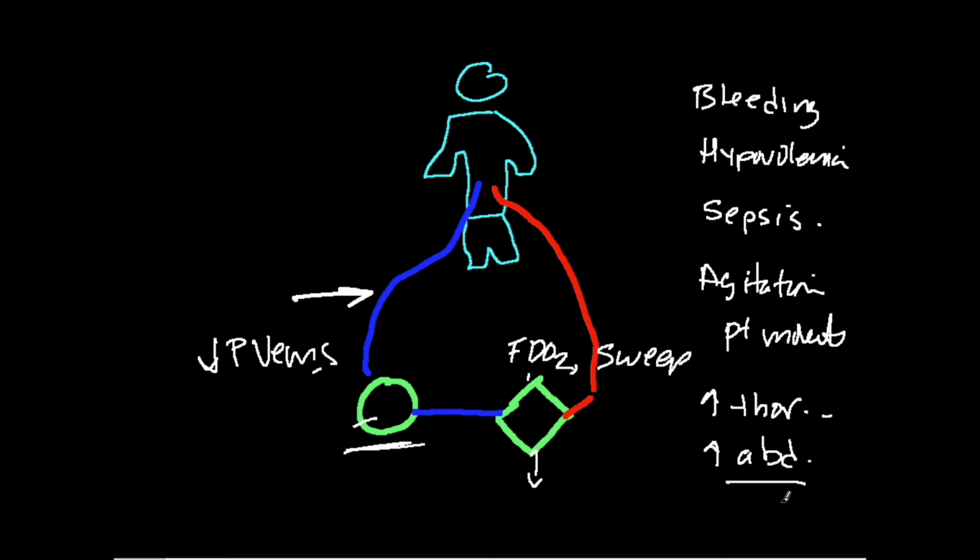And then finally, the cannula can be misplaced. This could be something that's been chronic and not noticed before, that's just been exacerbated by any of these factors, or it could be just due to the fact that somebody tripped and fell and pulled the catheter out and it's no longer in the right spot.